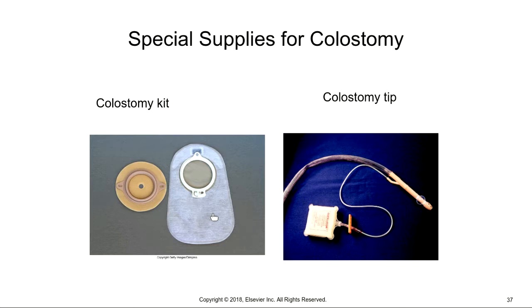Okay. Some of the indications, I didn't mention that, for a patient having this would be to have proper healing of the section that was removed. It could be a possible obstruction that they're relieving, or they can test for leakage to perform a pre-surgical evaluation. So I can tell you that when my friend had her large intestine removed, before they performed the anastomosis, they basically tested both sections of it. They put a regular enema tip into her rectum.